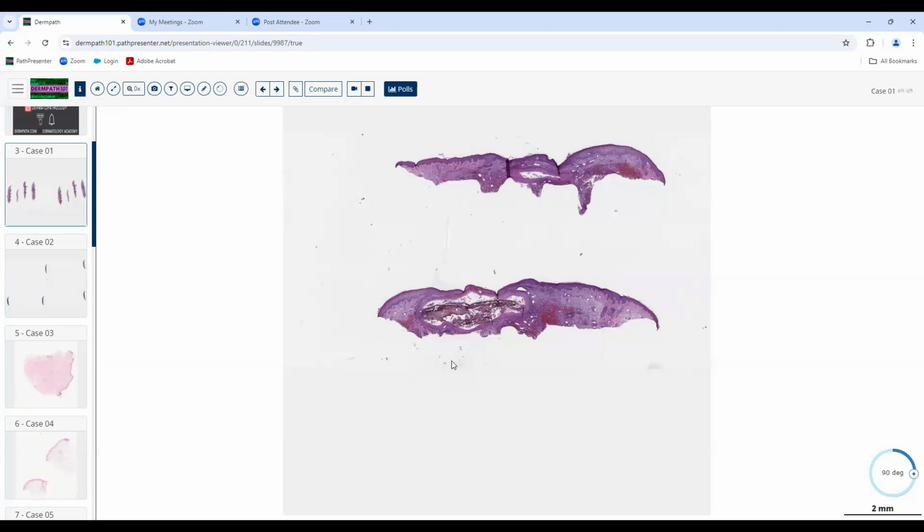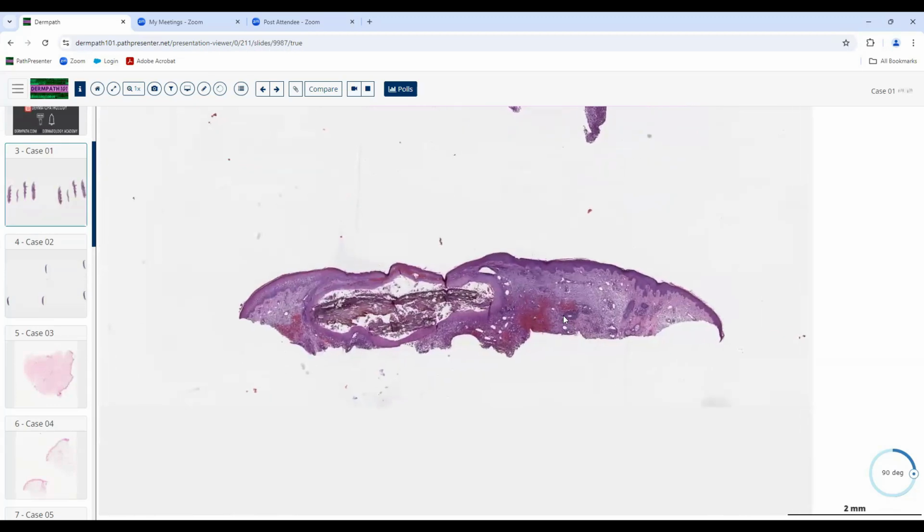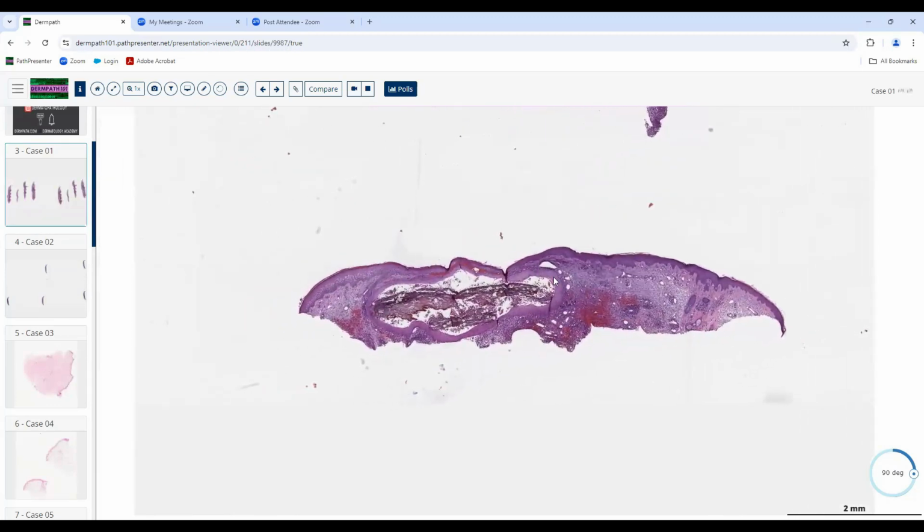So I was never really taught that you think about inflammatory things in the differential of neoplastic diseases when we were residents, but in the real world, you see that all the time. And we see tons of lesions that are sent in to rule out basal cells that are ruptured folliculitis or something else. So they probably sampled this by shave technique thinking it was a cancer. Probably it was a little bit of an elevated papule, and they did a little saucerization of it.